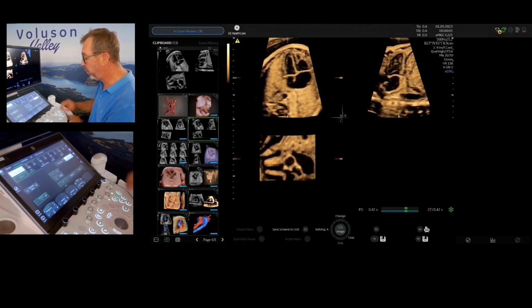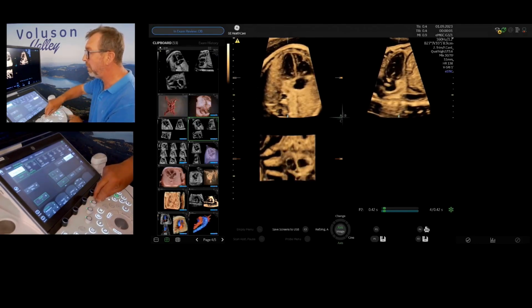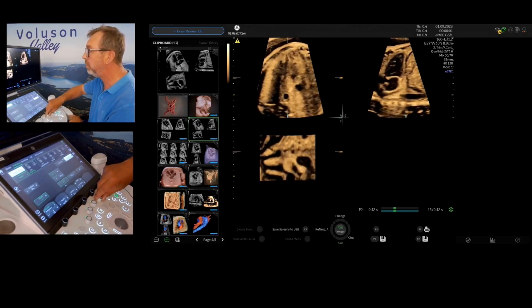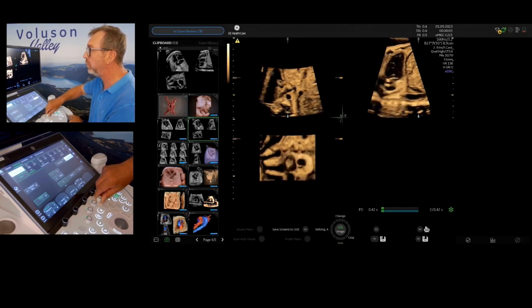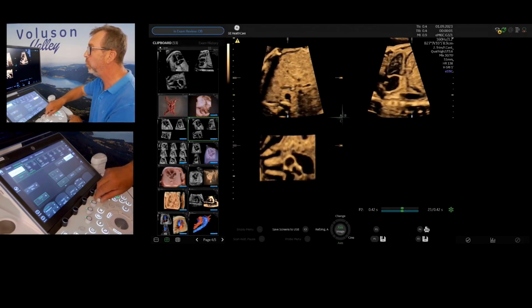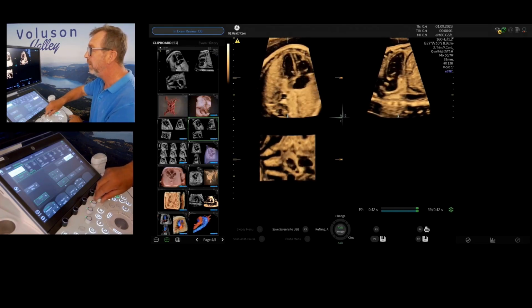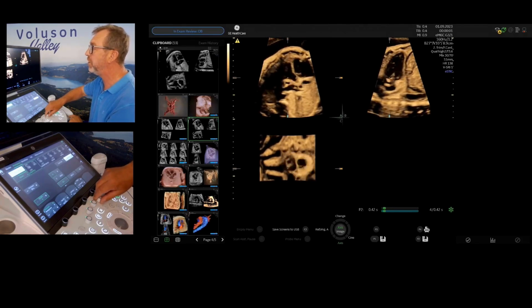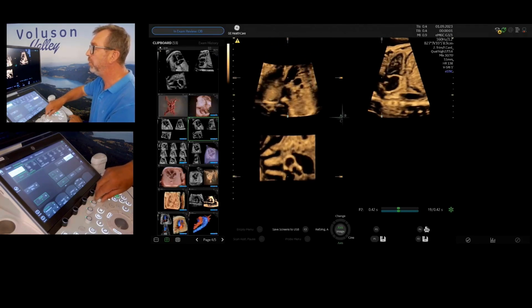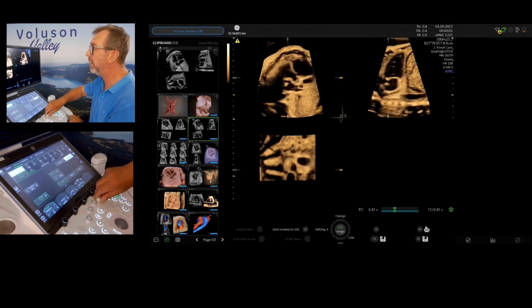The next step, what I would do is I would do a parallel shift going through the volume to have a look to the complete stored volume if everything is in the volume what you expected. Scrolling a little bit higher, showing you in the A plane the so-called 5-chamber view, going further, and the 3-vessel trachea view, and going back again.